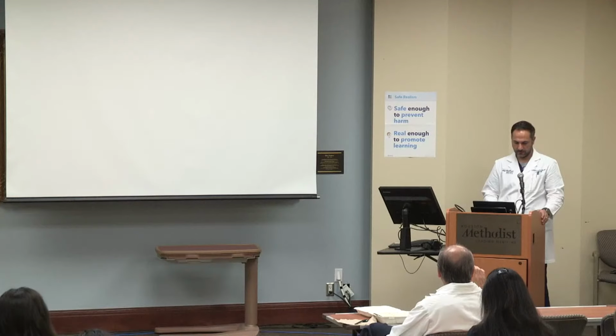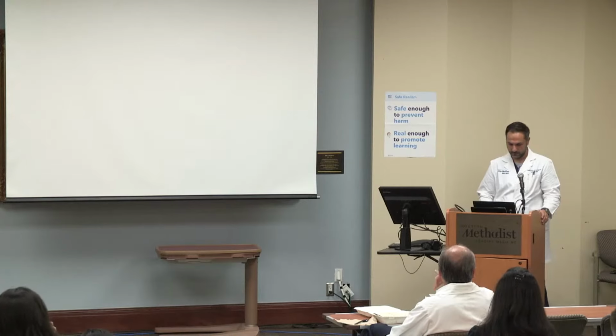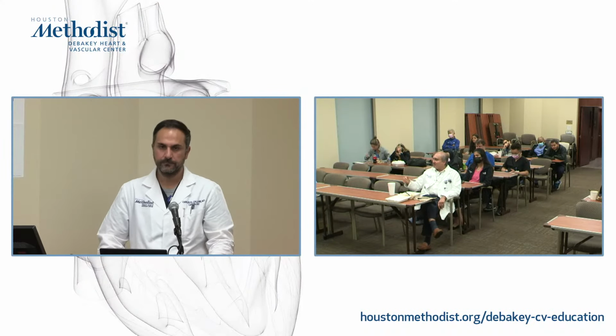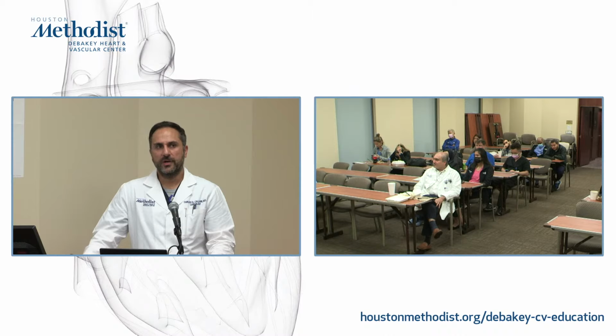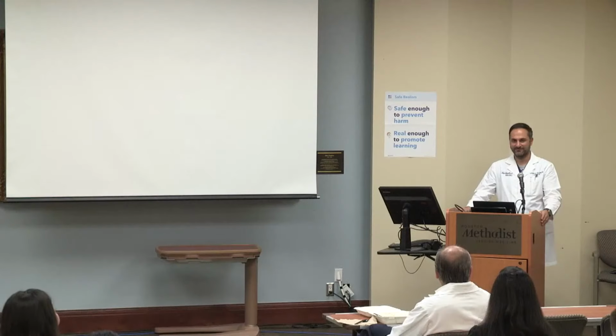Yes. So the idea is really that giving contrast and looking at differential tissue contrast is the key thing, to be able to identify especially these mural thrombi, which can be layered against the wall. So it's really hard to differentiate what's wall versus the fact that there's a thrombus in there. I agree. So contrast MRI versus contrast echo, MRI is still better, and as we mentioned, it's mostly because of the field of view, because of detecting those layered thrombi or the thrombi that were not captured on the plane of the echo. All right. Thank you.